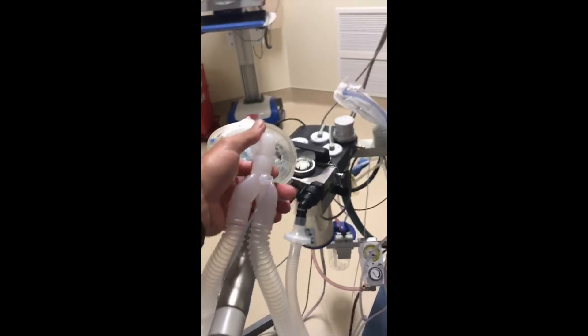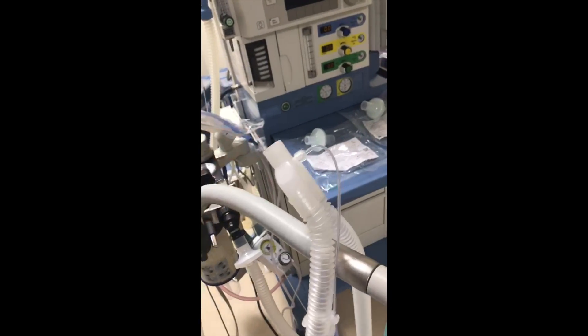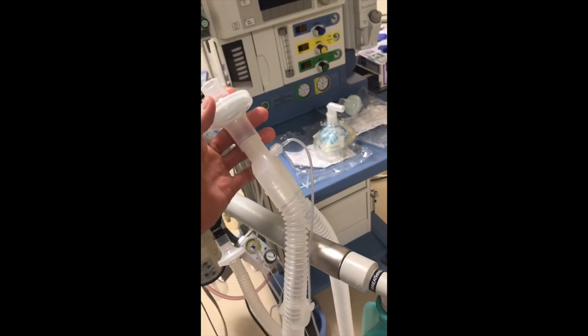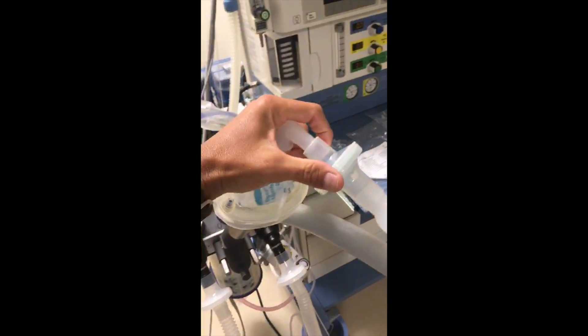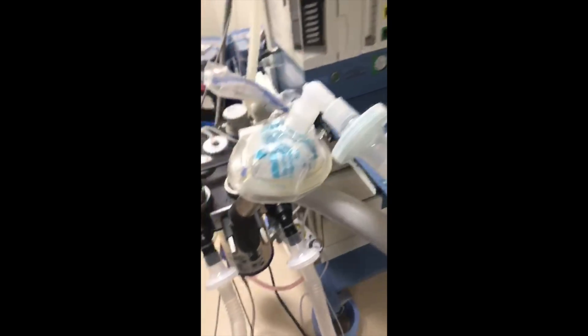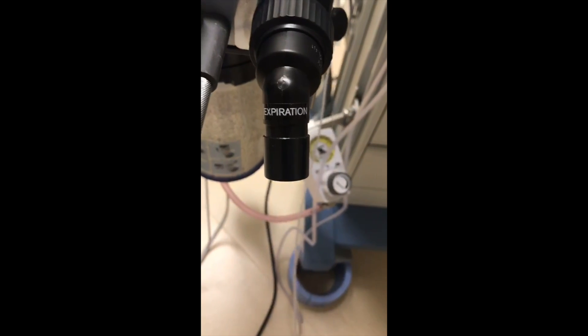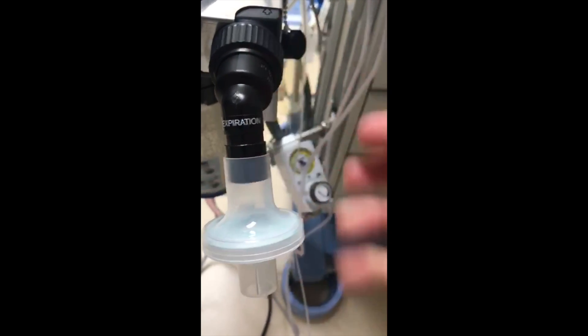We have a couple of Airlife viral bacterial filters, and the circuit is already set up. We'll hook the bag up and show the correct position of the first viral filter, which we'll put in front of the sampling line — make sure that's tight. Then we'll take the other one and attach it in-line. That's the normal standard filter that comes with this particular circuit, but we're going to put the viral filter right in front of the expiratory valve.